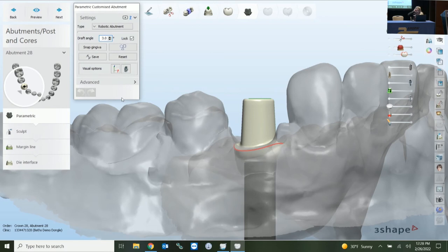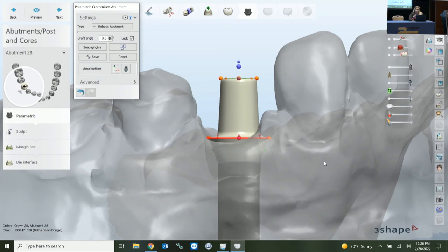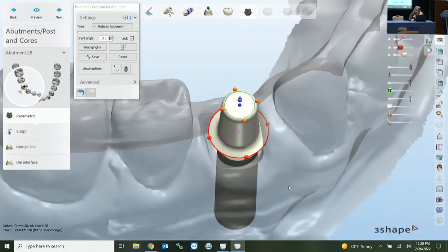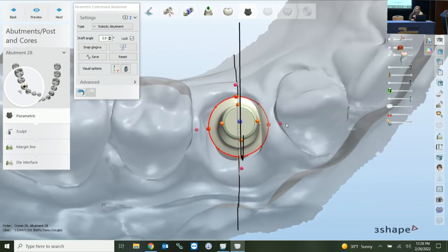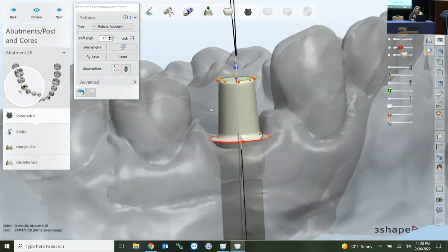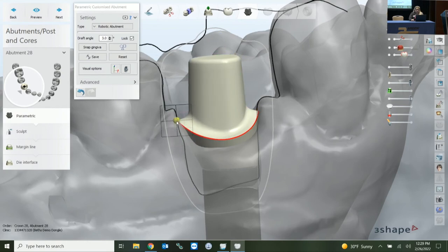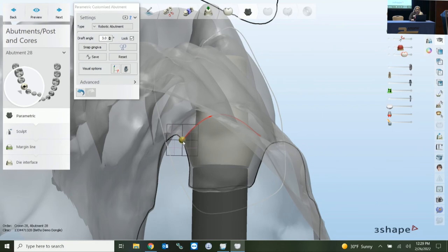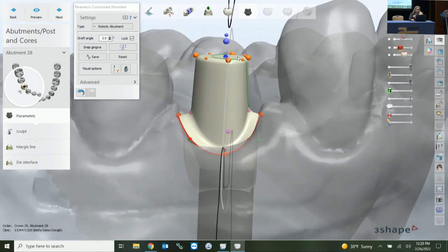Coming into abutment design, with any split file it wants a basic crown pre-design first. For abutment design type, robotic is my preferred because it's consistent through all 3Shape workflows and gives the most control. I typically start with a full reset so you're starting with a blank canvas rather than fixing what 3Shape presented. Get your four main dots in their respective positions of buccal, lingual, mesial, and distal first — if they're in their respective positions, the design behavior will be in your favor.